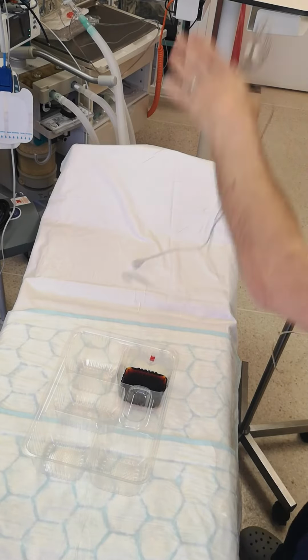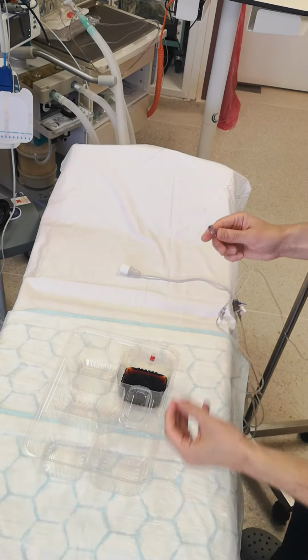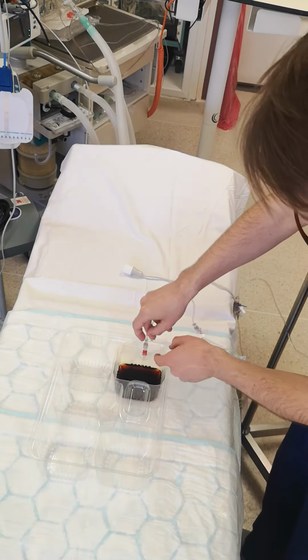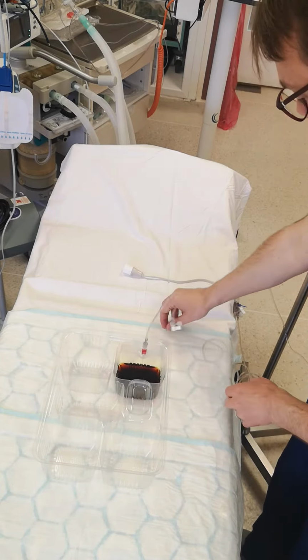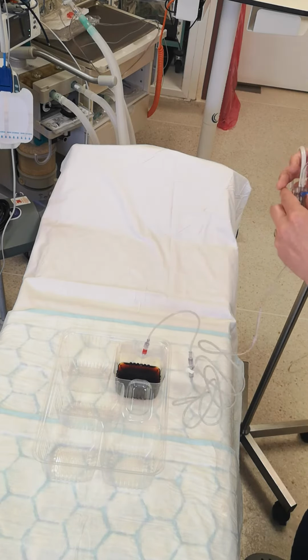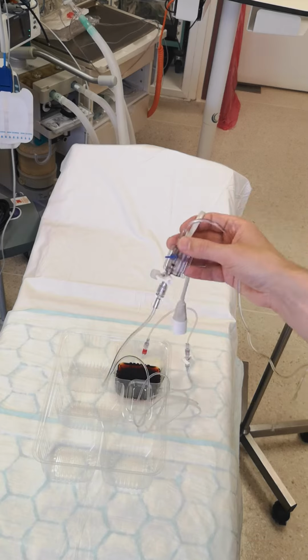Okay, so here we have the patient. So cap off, twist onto the cannula, and make sure that the flow switch is open. That attaches to the monitor. But for this demonstration, I'll just leave this here so we can see.